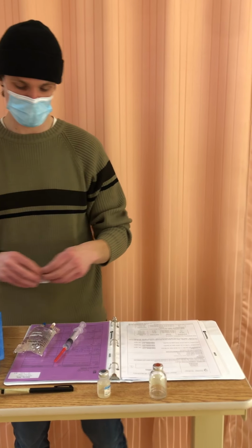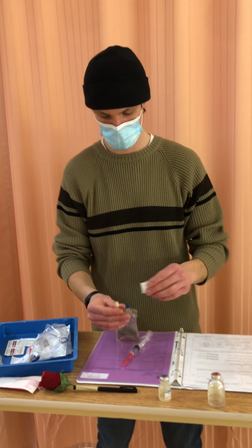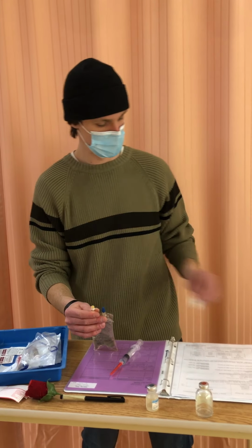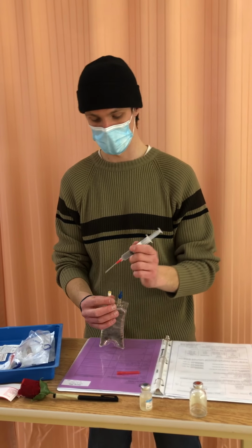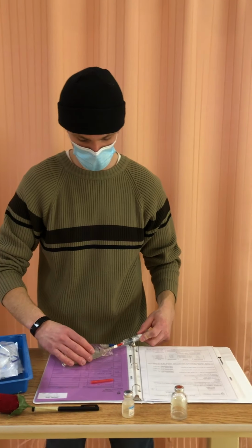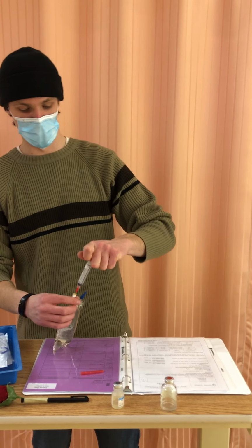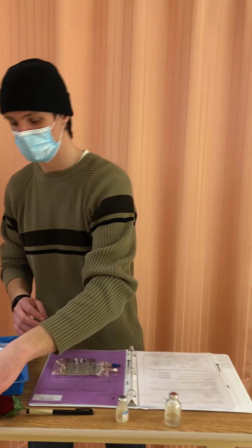inject the medication into the Minibag here. So again, clean for 30, let dry for 15, and without contaminating sterility, inject here and go ahead and inject the medication and draw that out. I won't be needing this anymore, so I can put this back. Now I can go ahead and create my med label.